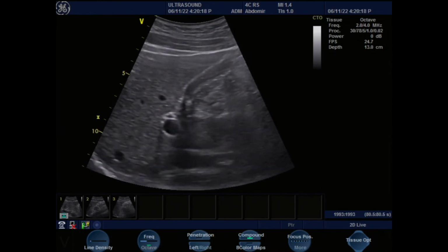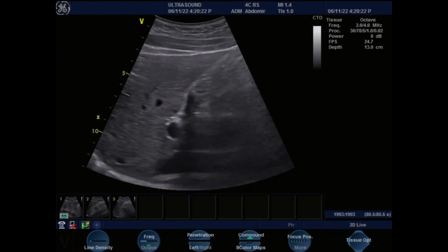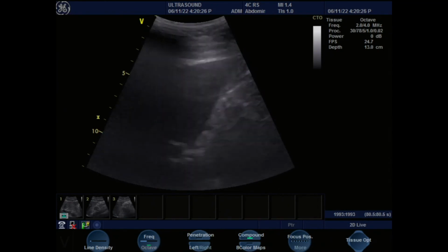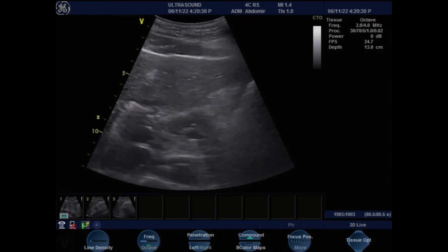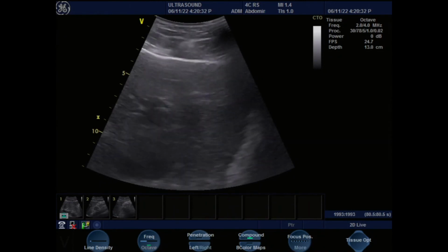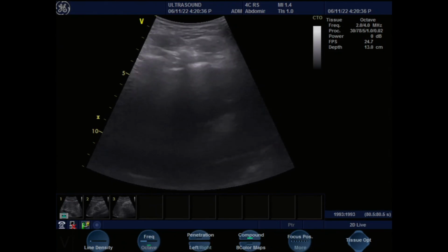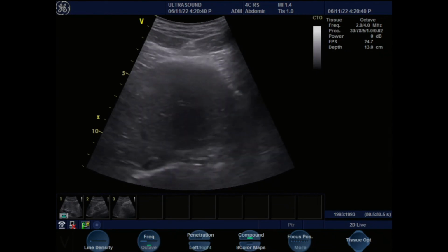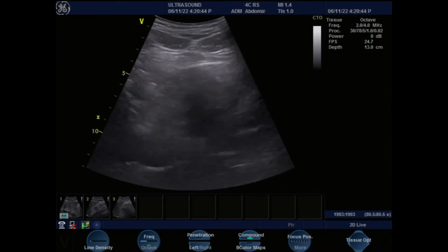Yes, just at an angle, because you're going to look at the picture and please breathe, don't turn blue. So you're going to look at the screen and then tweak your probe and turn it accordingly to see how it is changing the image. So if you turn the probe one way and you see it's getting shorter and going more transverse, you slowly turn it the other way to stretch it out more sagittal. And that's the left portal vein, we're getting there. All right.